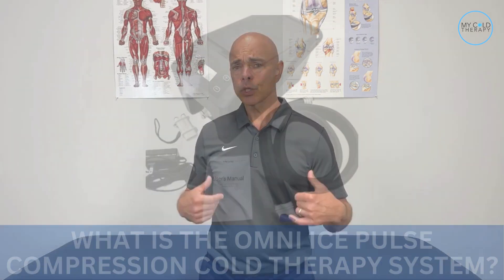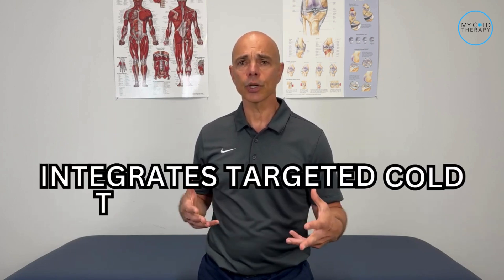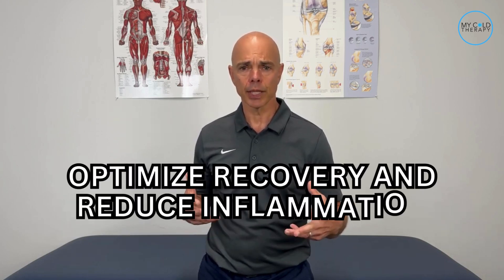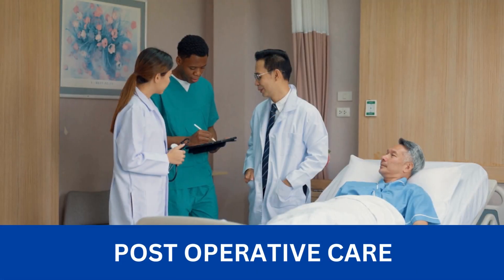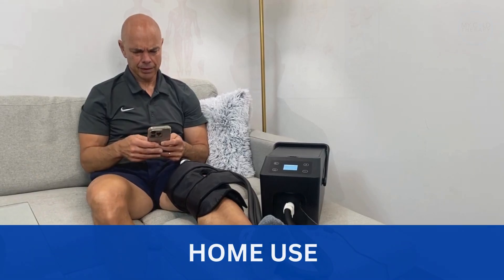Now let's jump right into it. Compression cold therapy is an awesome way to help relieve your pain and swelling after surgery, injury, or just a hard day of being a weekend warrior. The Omni Ice Pulse Compression Cold Therapy System is an advanced device which integrates targeted cold therapy with pulse compression to optimize recovery and reduce inflammation. It's particularly beneficial for post-operative care, training situations, and home use, setting the standard of care across the industry.